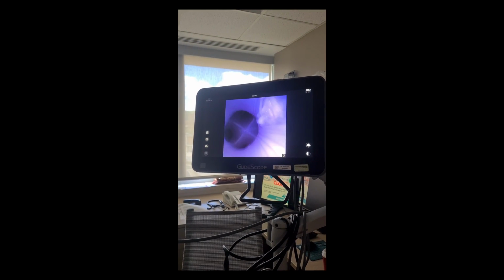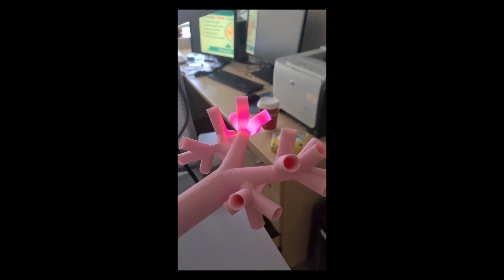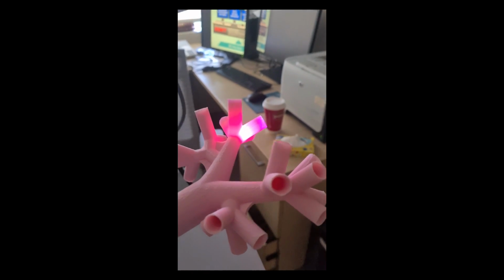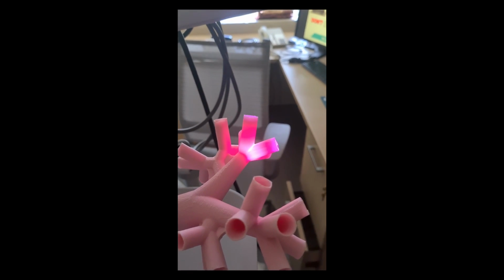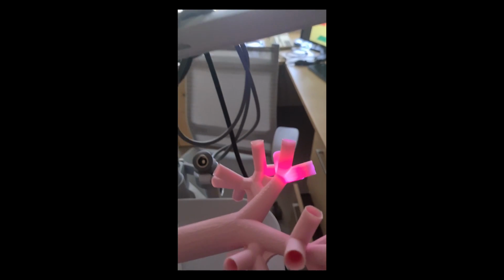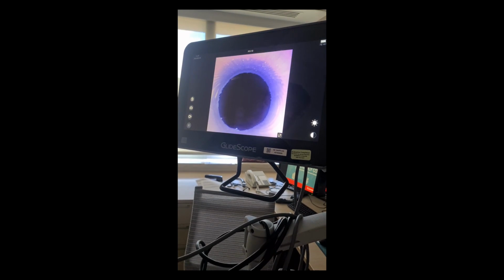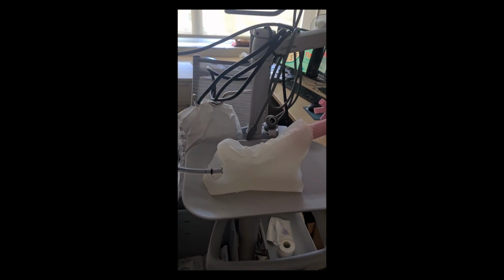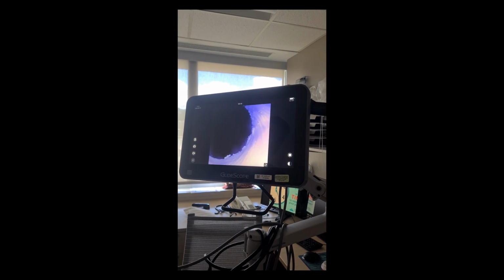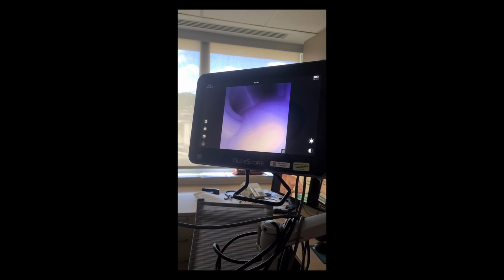As we go into the left lower lobe, you can see the bronchoscope coming out of those small bronchioles. Or if we go into the right side, I think we will be able to see the bronchoscope coming out of here. And that's how much we can go in with the actual bronchoscope, because the tinier these bronchioles become, the harder it is to get into them. Yeah, so overall, I'm really impressed with the 3D printed model.